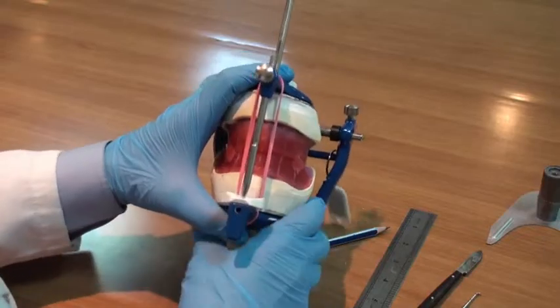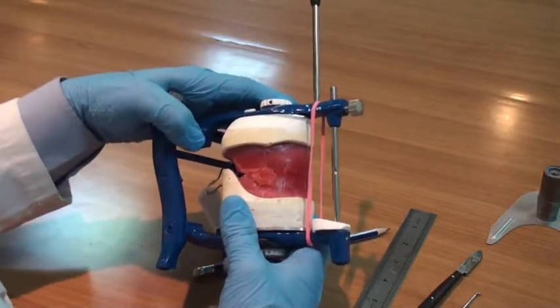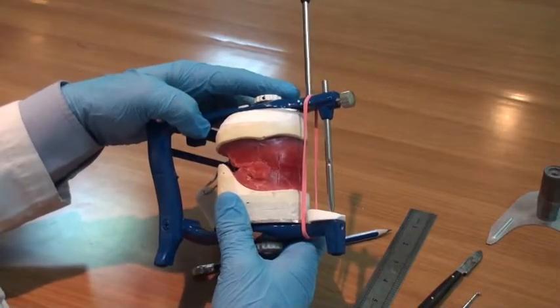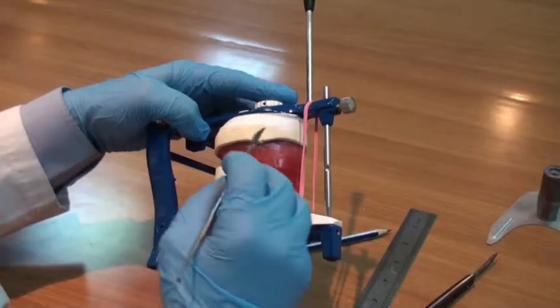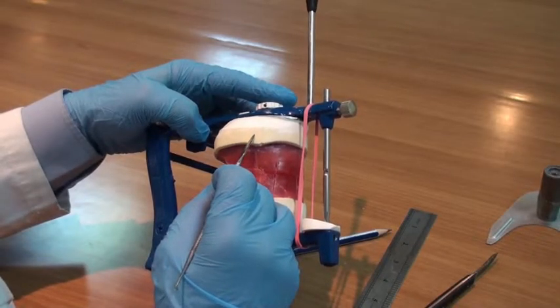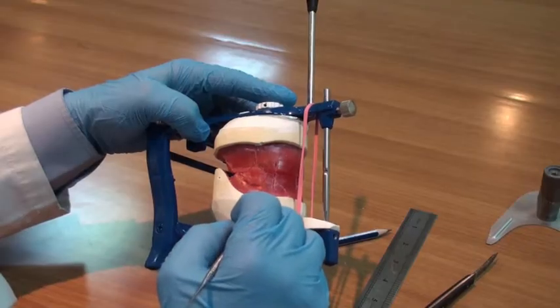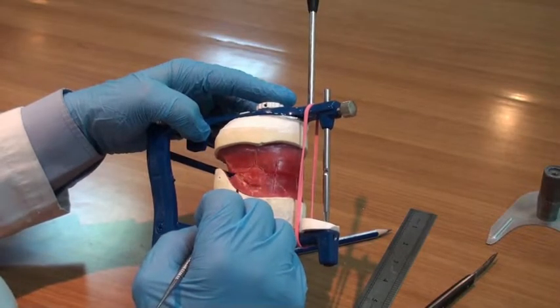Now, the second determination transferred from the patient's mouth to the articulator via the occlusion wax rims is the horizontal relation of the mandible to the maxilla. This horizontal relation is the centric relation of the mandible to the maxilla inside the patient's mouth.